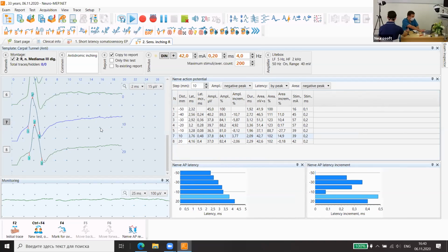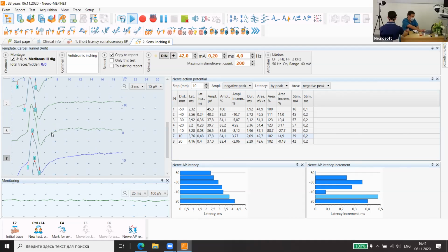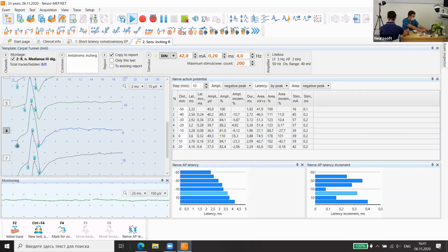Evgeny, please see on the 6th trace there is no response. Please mark it. On 6th trace. Yes, sorry.